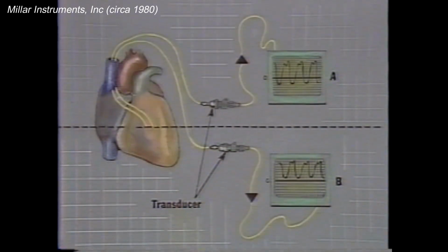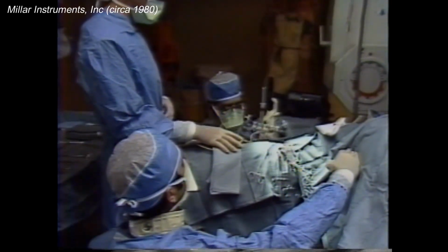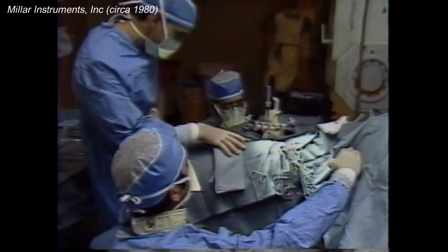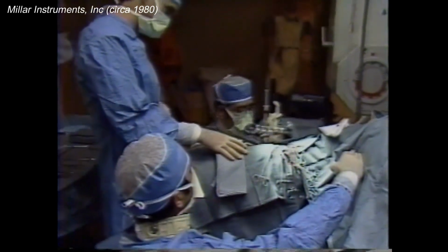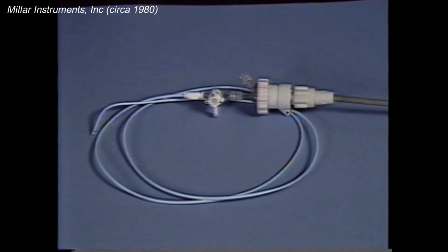The external pressure transducer must be carefully placed to approximate the position of the tip of the catheter within the body. If the transducer is not positioned exactly, then the hydrostatic pressure differential can result in inaccurate pressure readings. Since the relative position of the external pressure transducer and the tip of the catheter must be estimated, it is logical to assume that some error will occur in all fluid-filled systems. While there are other characteristics in fluid-filled catheter systems that can cause error, these areas are the most significant.